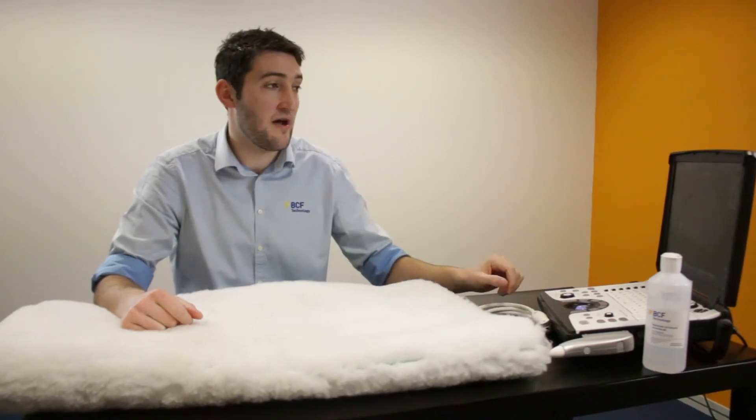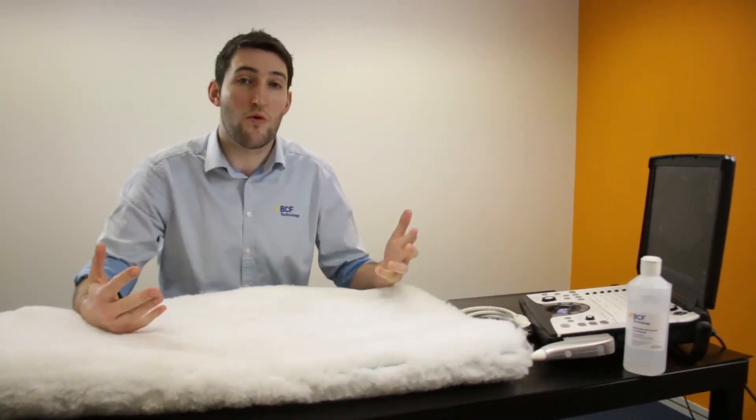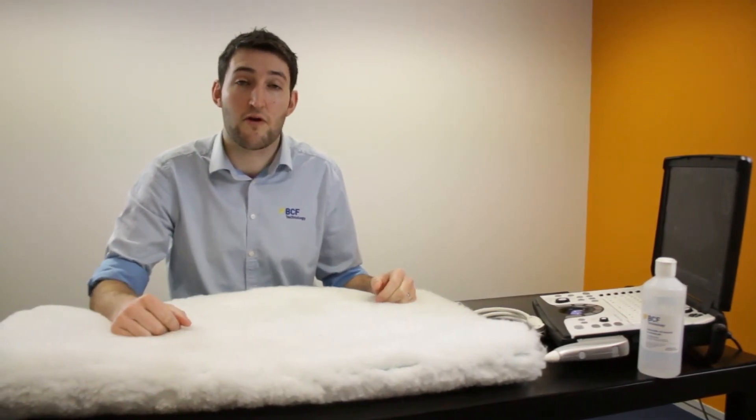Then we need the machine — an ultrasound machine. A quite nice portable small ultrasound machine, whatever's available. Make sure you familiarise yourself with the controls beforehand.